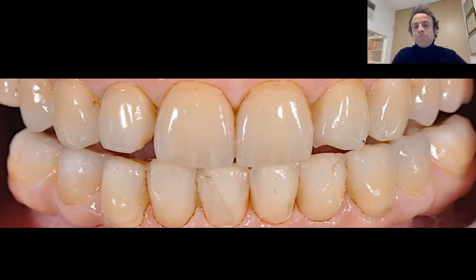Because we know that feldspathic porcelain, after 48 hours in the mouth, absorbs saliva, absorbs water. So if you go in the oven again for modifications to repair some chipping, the firing process can create a strong elimination of water from the inner portion of the porcelain, and this can create microcracks that can compromise more and more the feldspathic porcelain reconstruction on the occlusal and on the buccal aspect of our rehabilitation.